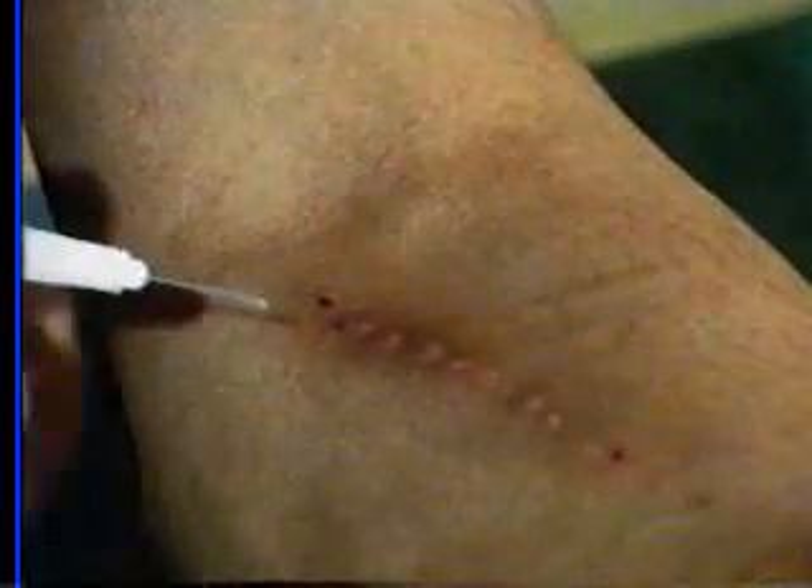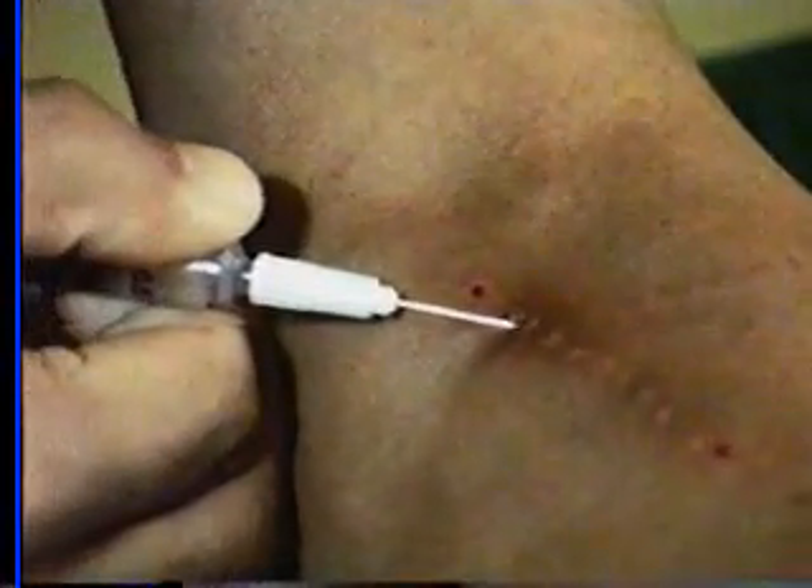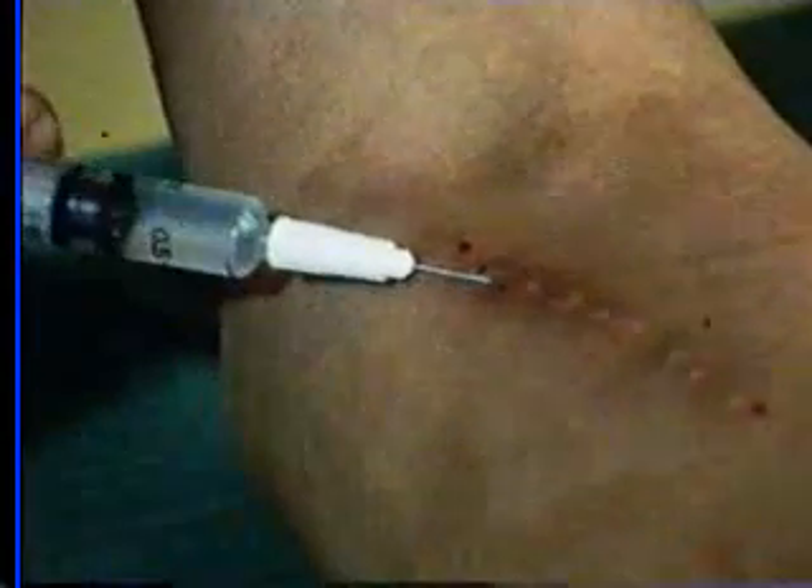He now takes a syringe of local anesthetic and introduces a small quantity subcutaneously or intradermally.